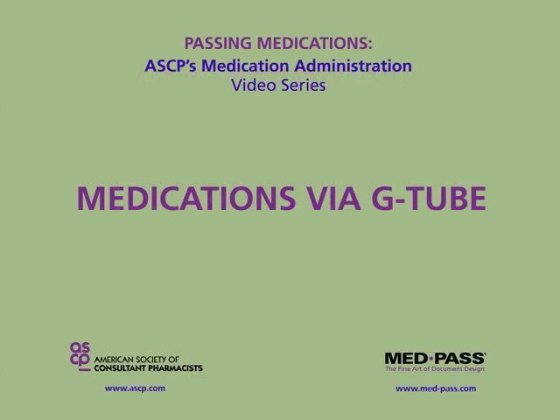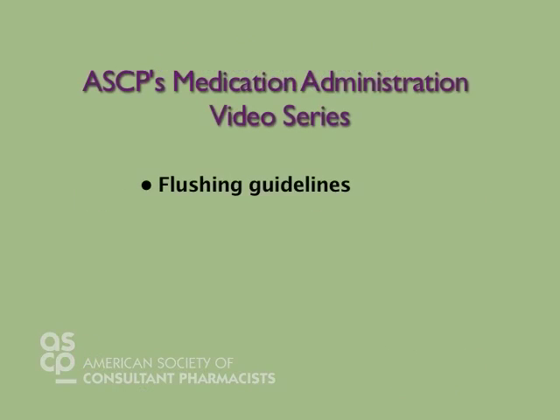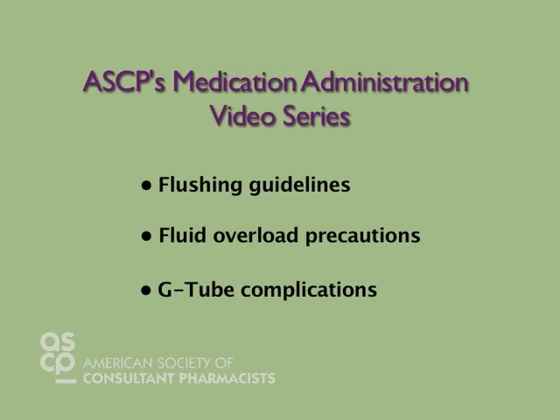In the next 15 minutes, we will observe a video presentation detailing the procedure for administering medications by way of a feeding tube called the gastrostomy tube, or G-tube. We will address flushing guidelines and fluid overload precautions, and ways to deal with some potential G-tube complications.